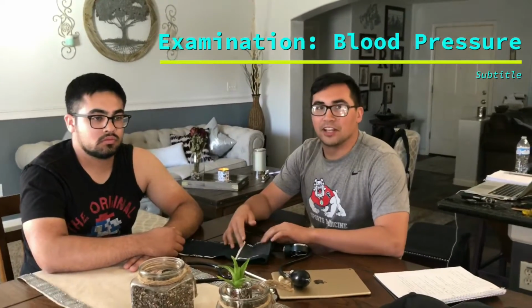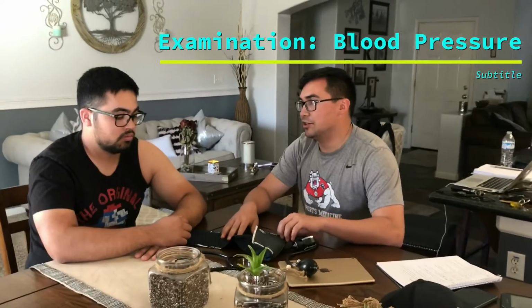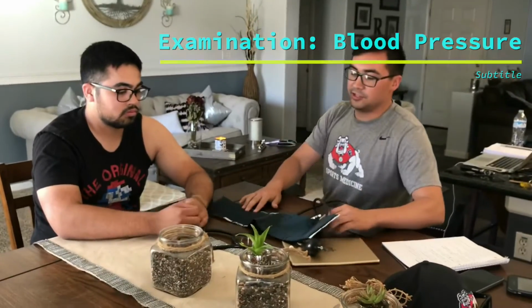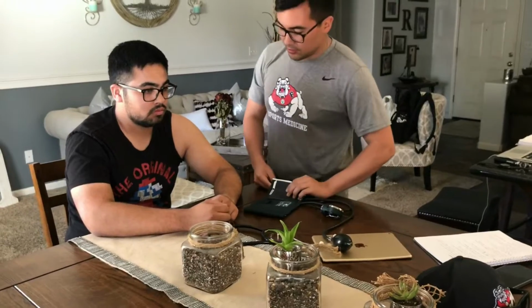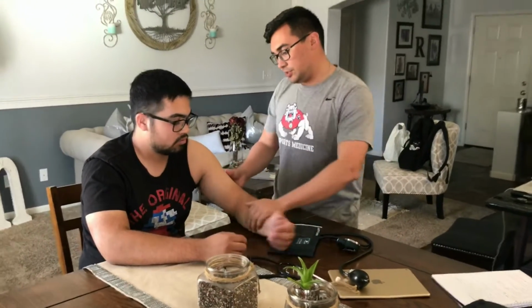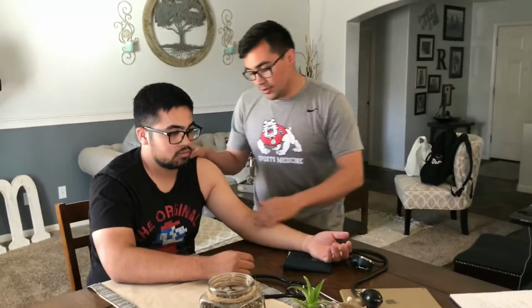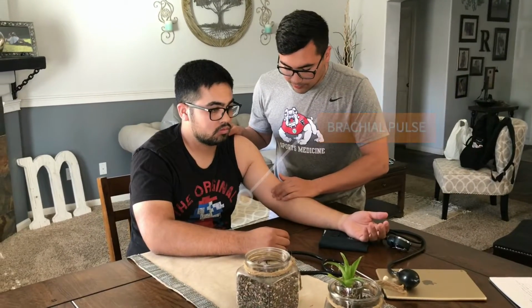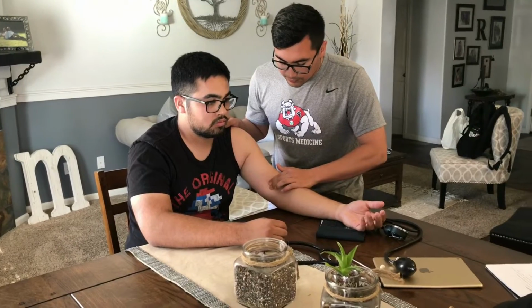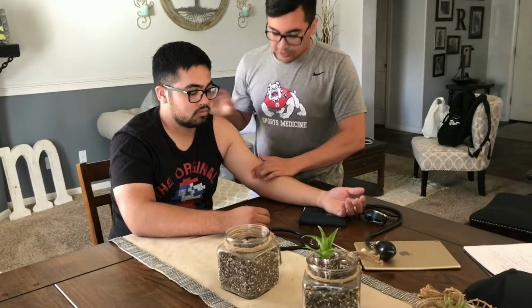Alright, so we're going to be doing a blood pressure examination on Michael here. First thing you want to do is make sure you have a cuff that is of appropriate size. Looks like large will be fine for Michael. One of the first things we're going to do is look for that brachial artery pulse. It should be on the medial side of the arm right here. Just got to look for it. Alright, looks like it's right about here.